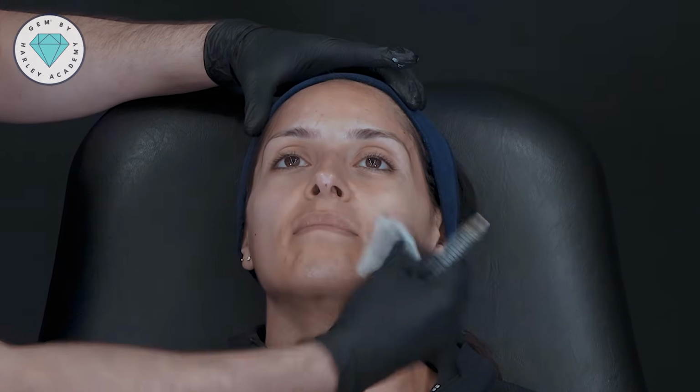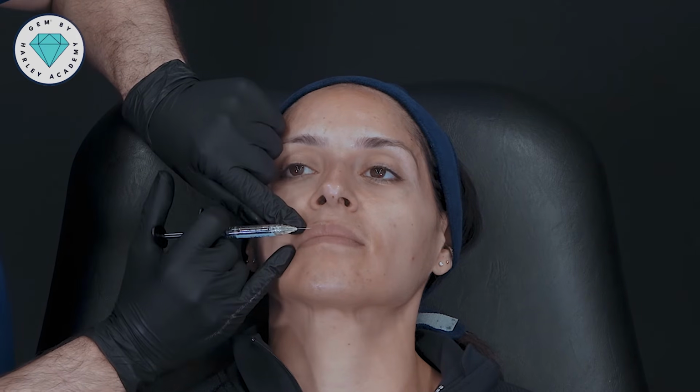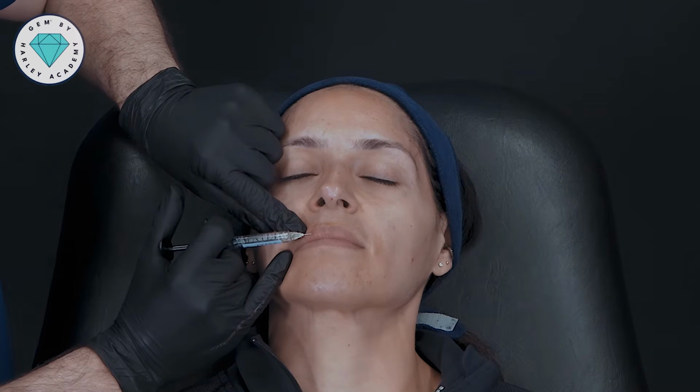So I'm going to show you a bolus technique here, because when we have what I would describe as technically easy lips like these ones, we don't need to overcomplicate things. I'm going to let the filler do the work, and that means that I'm going to rely on the gel moving anterograde through the lip. And so if I just make my little entry point here, and then just slowly add some pressure, we will let this medial compartment of the lip fill.